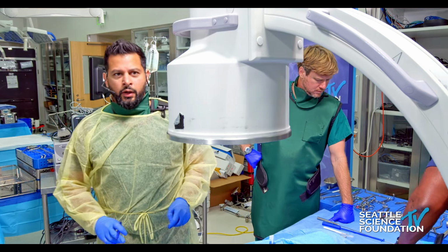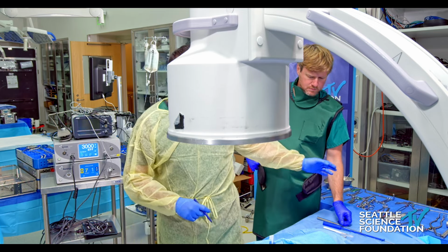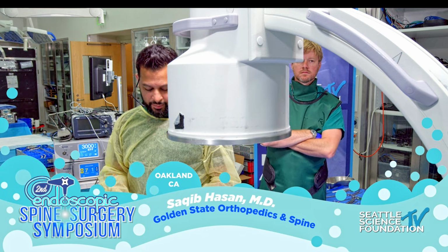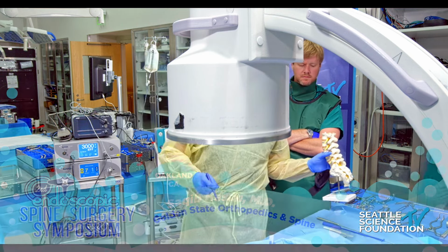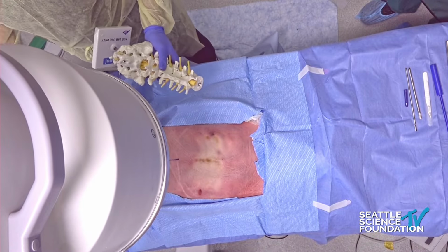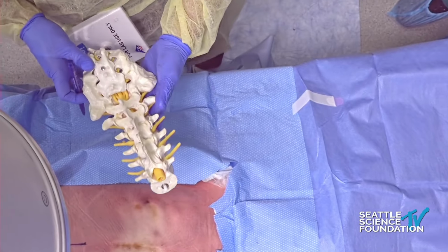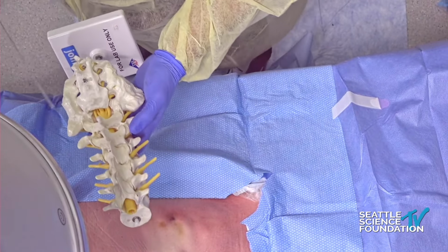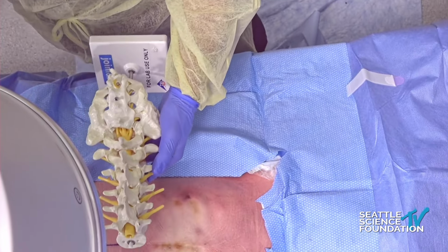Excellent. Okay, so we talked about the interlaminar technique, and it is kind of the workhorse for posterior-based surgery, kind of the same idea Dr. Yoon is going to talk about for biportal. Where's the camera? Right there. So you can see that we now have a normal cadaver, so it should be a lot easier. Bottom line is, this is a very easy targeting in terms of getting there. Transforaminal is a little bit more complicated, because with transforaminal you are essentially coming from an angle.